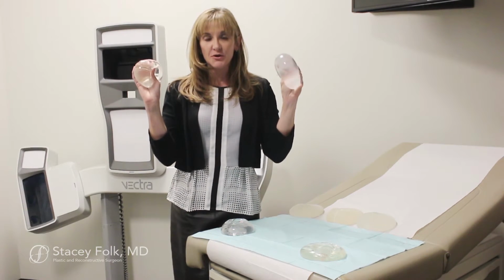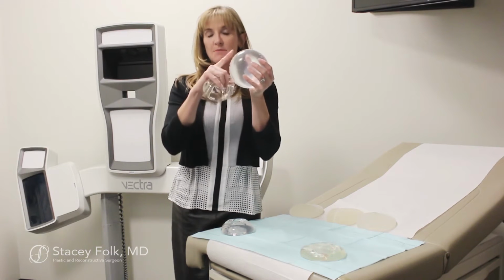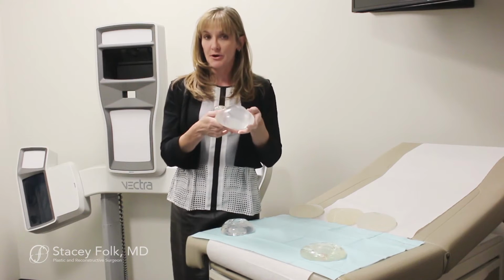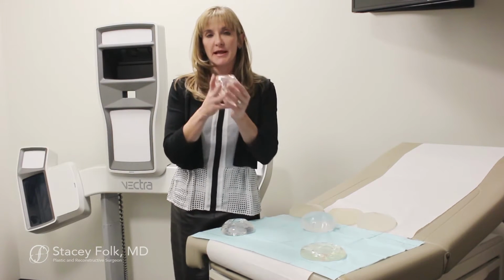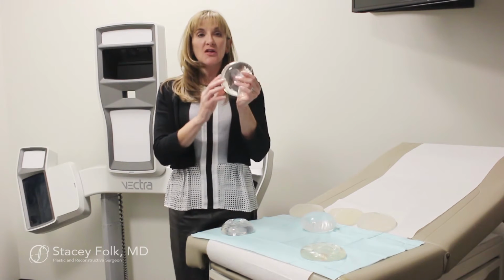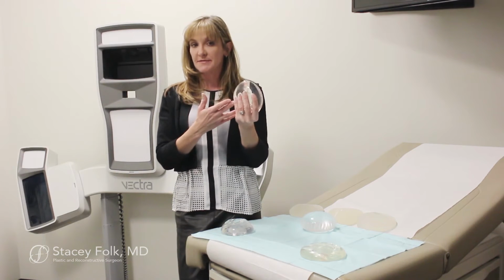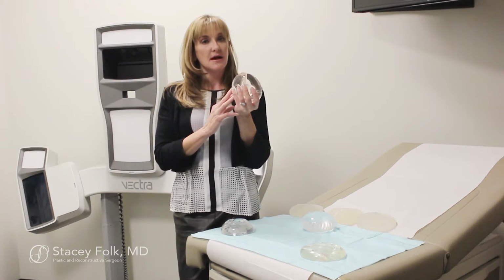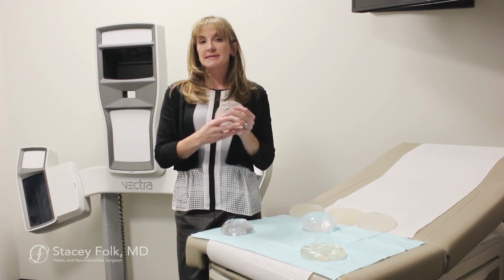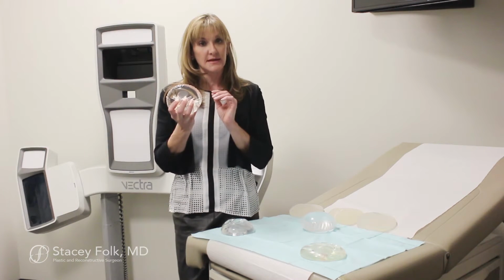Now, they both feel very different. Saline's going to be quite a bit firmer and possibly have more of these ripples. Also, when this one springs a leak, it's going to deflate or go flat. A silicone implant is going to feel much softer, like a natural breast, and the gel that's used inside the implants these days is thicker than the old implants from the 70s and the 80s, and the shells have become quite thicker. So there are a variety of different implants that have various degrees of what we call cohesivity, or the thickness of the gel on the inside.